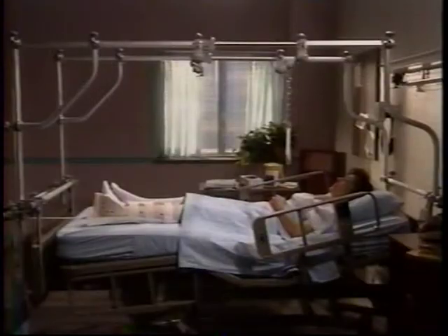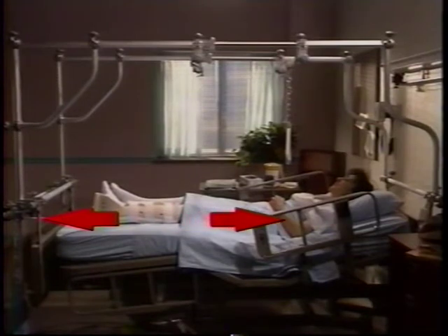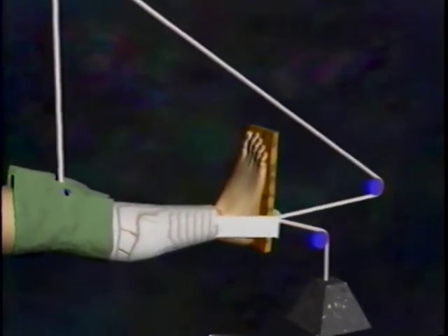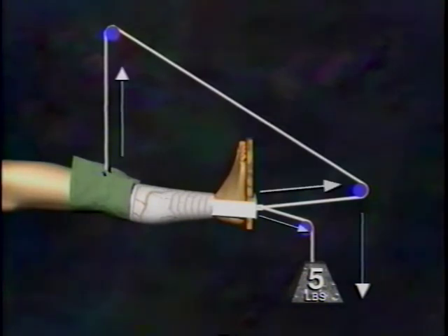Traction is defined as the application of a pulling force to an extremity or some other part of the body. At the same time, an opposing pull or countertraction is applied. Countertraction can be provided by the patient's own body or the position of the bed. Traction force is created with a system of weights and pulleys. The weights provide a constant force, while the pulleys provide the constant direction of the force.